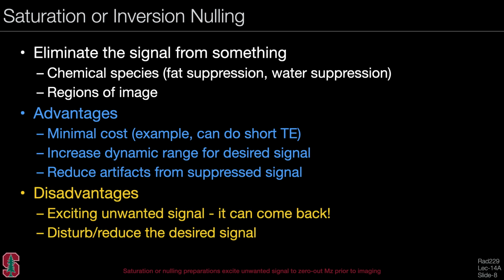Some disadvantages of these approaches are that you are exciting unwanted signal and you're somehow nulling it, but it can come back. And the other disadvantage is some of these schemes can disturb or reduce the desired signal, so that this contrast comes at a cost, perhaps, of signal-to-noise ratio in your desired signal.